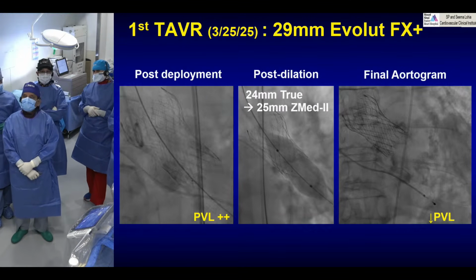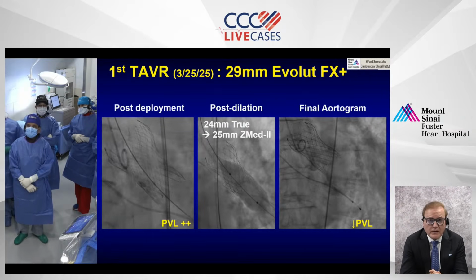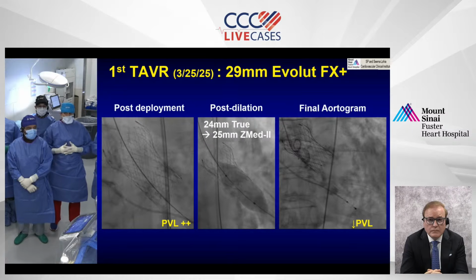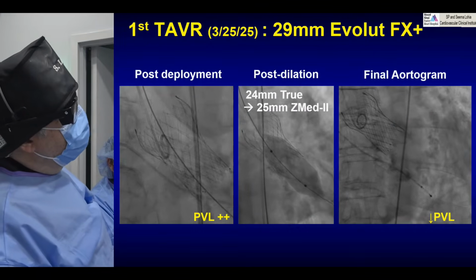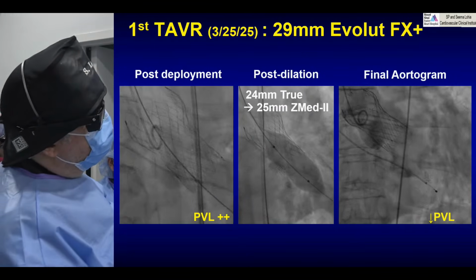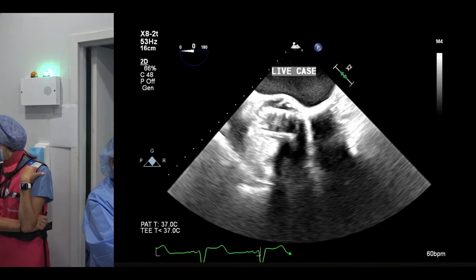Now, there's still the question from Dr. Kinney to Stam, and the audience is important. What are the criteria that you use on the echo? I will show you on the case. As you know, there are many criteria, and you have to put them all together. The main criteria: one echo criteria, two non-echo criteria.